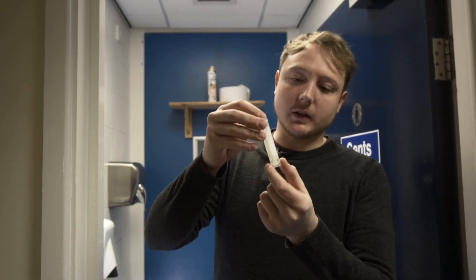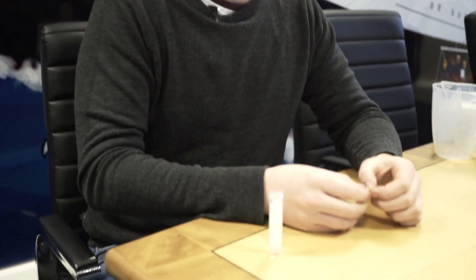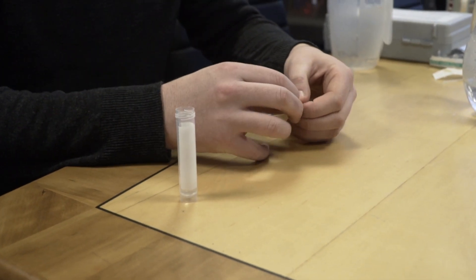So now that we've left that for 20 seconds or so, what we're going to do is take our normal pipette as we would with a normal test and do our sample. I will say now — if you're going to take a sample, do make sure that you use that sample within 10 minutes of first putting it in. It is really important.